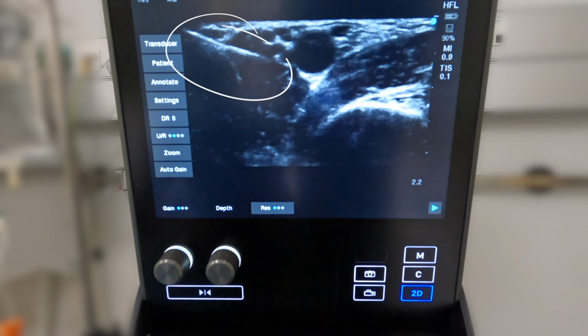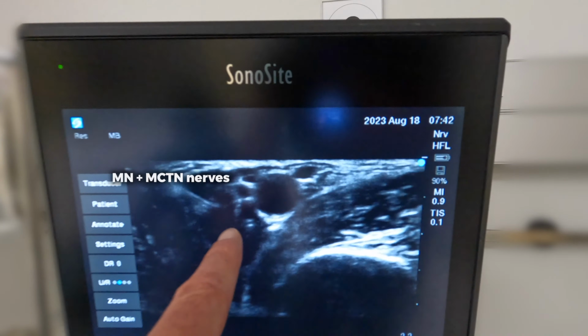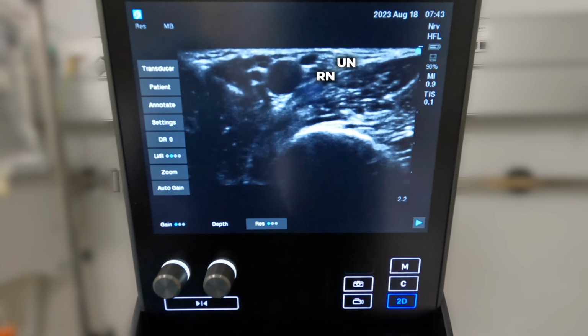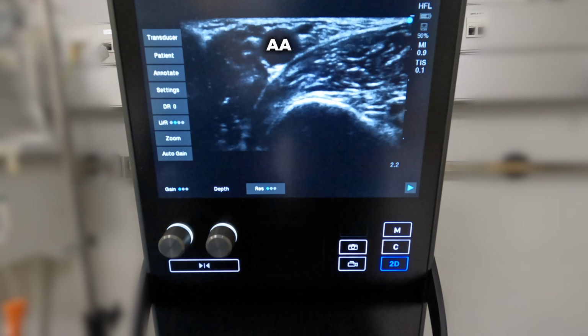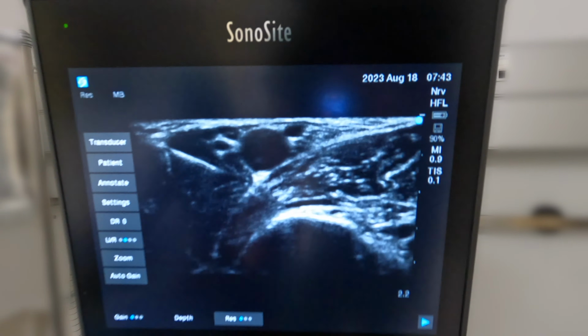Let's get a good view of the needle. Needle tip, yeah. Very good. So go. So that's the median nerve quite clearly. So we're going to go posterior to the median nerve. Yes, see the needle tip, then lift the needle tip up so it can go just underneath the artery into the plexus sheath. You don't want to do this, you want to go underneath the artery.